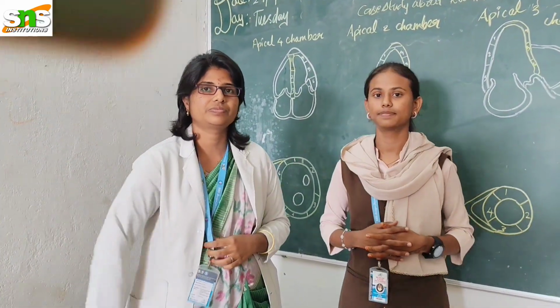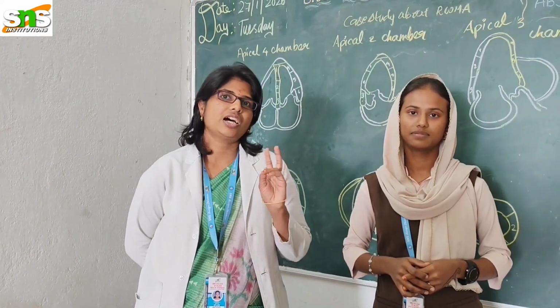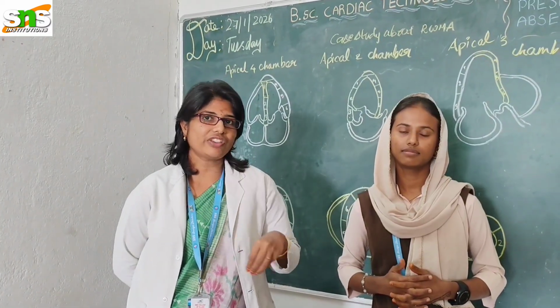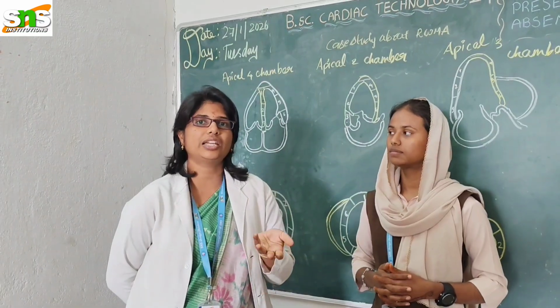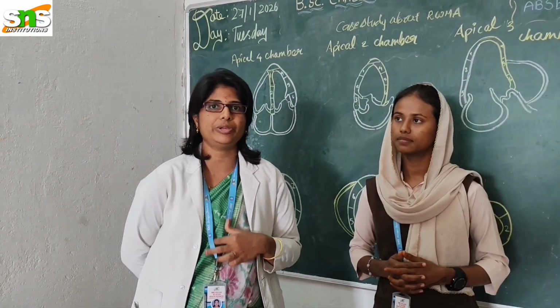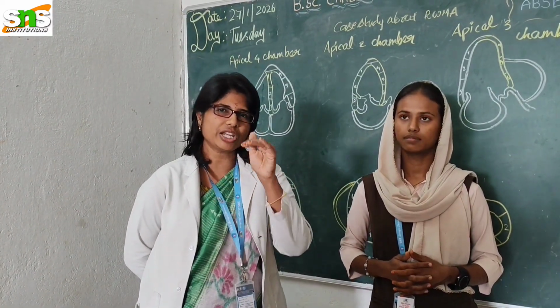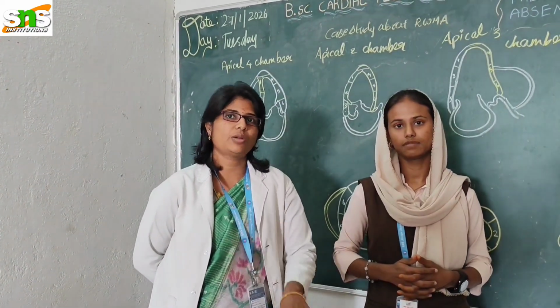Okay. And here the LV remodeling includes LV dilatation, the elliptical shape changing to a spherical shape, and thinning of infarcted myocardial segments, whether the inferior wall or the anterior wall is infarcted. It is thinned out and appears akinetic. LV dilatation signifies chronic ischemic damage, and it is also associated with reduced cardiac efficiency and poor prognosis.